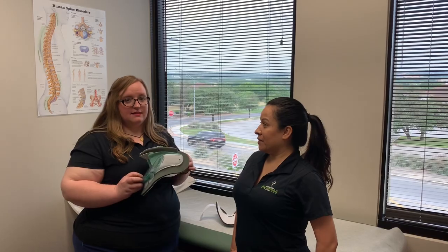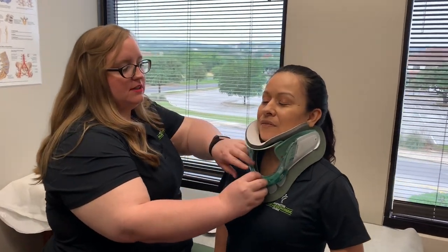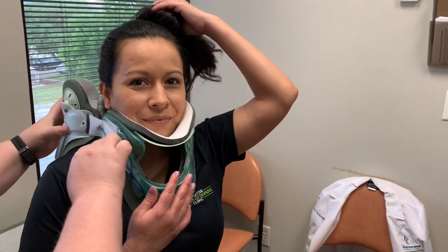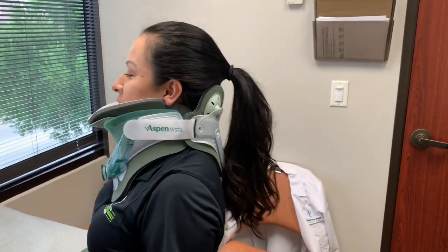This is how you put it on and how you should be wearing it after surgery. This piece goes up under your chin and then you would make adjustments accordingly. This piece gets attached here and then it goes around and straps over on this side. It should never be too tight or too loose.